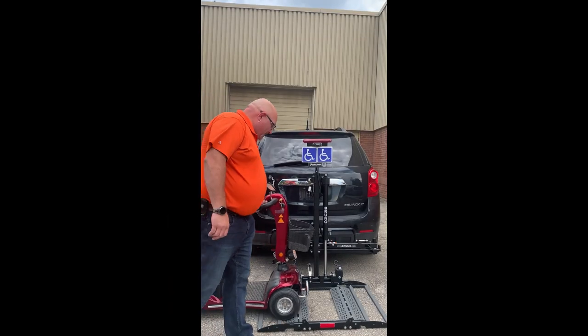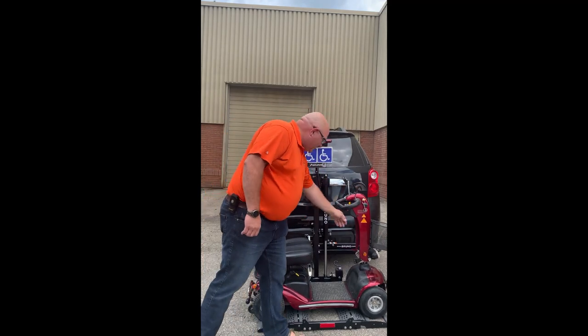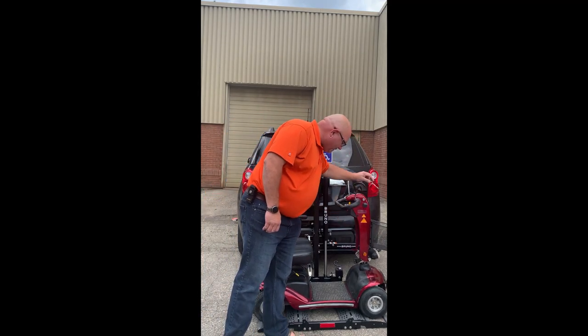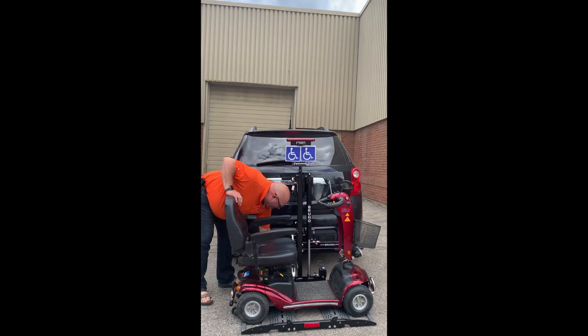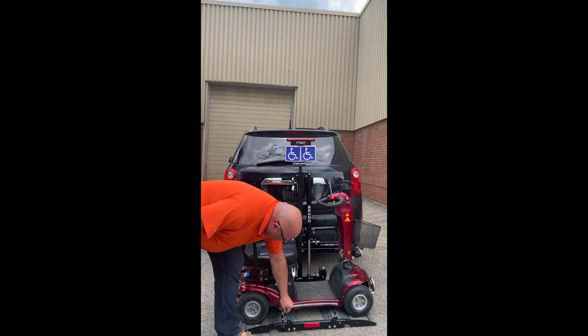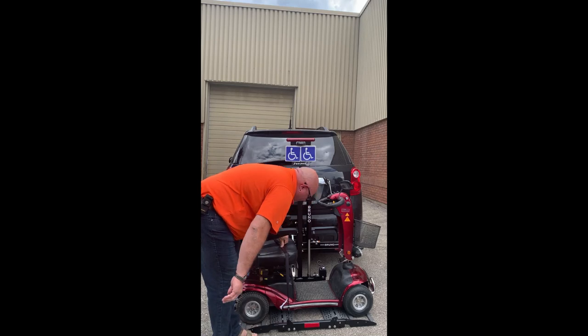Drive the scooter on top of the platform into the wheel truck spots. Turn the scooter off. I will take the securement straps over the seat and into the docking position for the back.